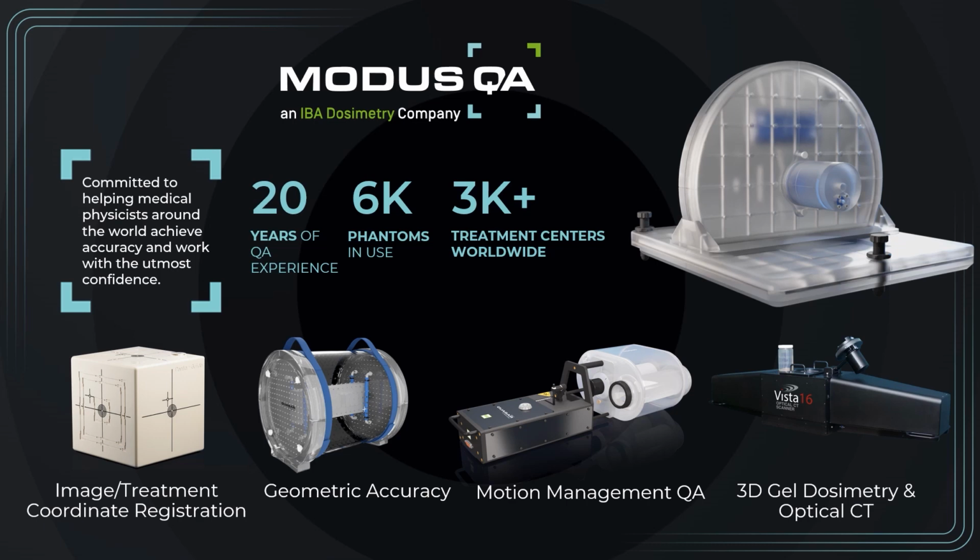Speaking of the actual QA tools, on the screen you see a small subset of our products, which some of you may recognize. Divided into categories, the Modus product catalog spans quite a variety of QA solutions, which includes targeting, geometric accuracy, motion management, 3D gel dosimetry, and of course MRI QA solutions, which is going to be the topic of this webinar today.